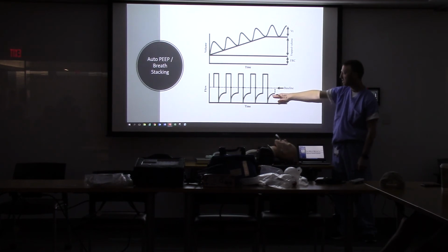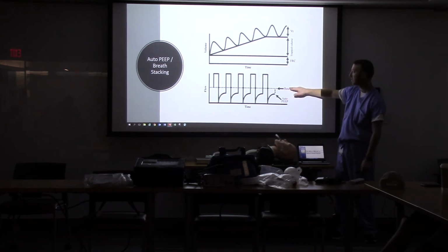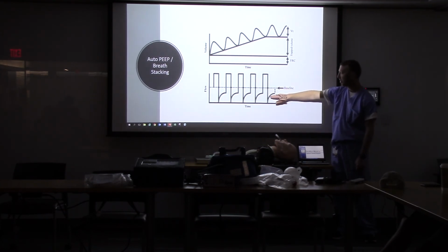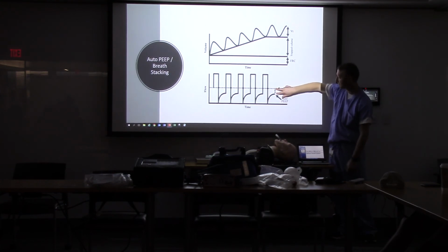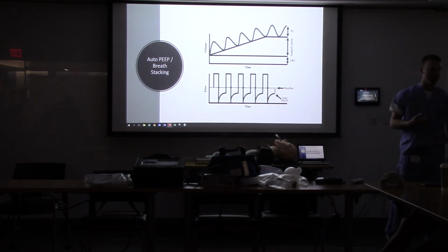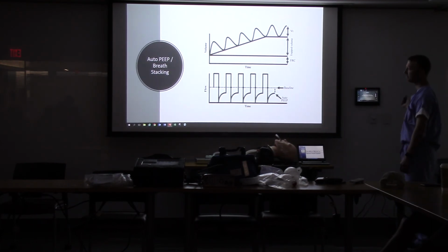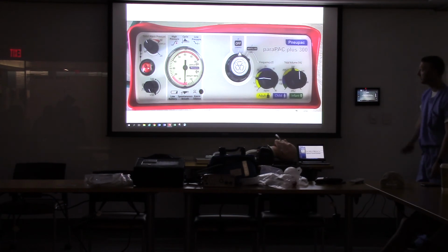Well, as it flows out, because it's taking a long time, if you don't give the patient a chance to exhale, and they need to get to here to be at a 0 flow, you've already given a breath, and this right here is called auto PEEP. Auto PEEP is internally generated PEEP because of too much pressure in the chest. That's bad.